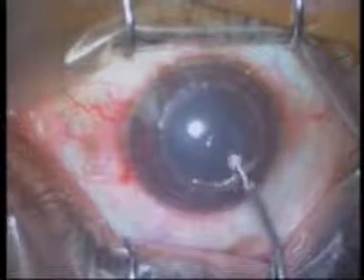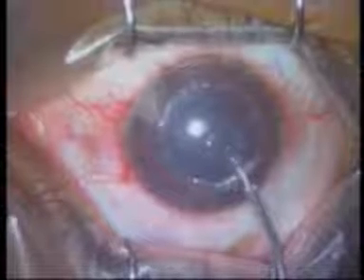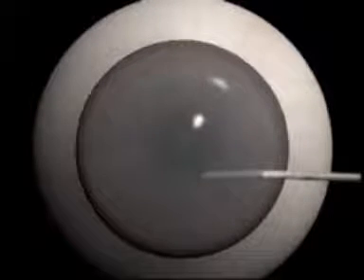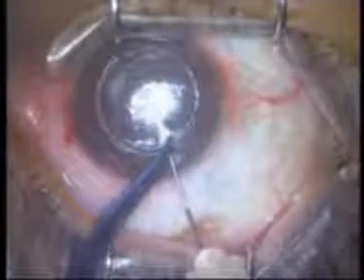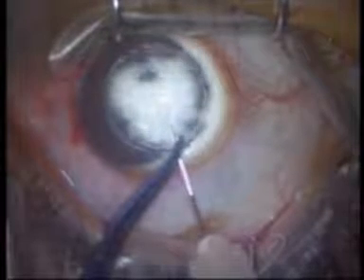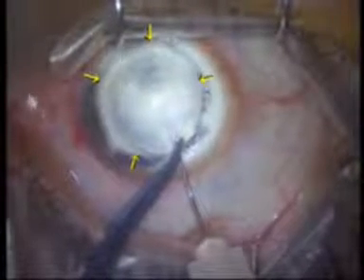A drop of viscoelastic can be placed on the surface to facilitate a magnified view of the needle tip. The bevel of the tip facing down is important to decrease the risk of penetrating the Descemet's membrane and to facilitate posterior spread of air. When the initial infiltration is accomplished in the central corneal disc, air suddenly forms a large bubble with a circular outline between the Descemet's membrane and the deepest stroma — this is the desired end point.